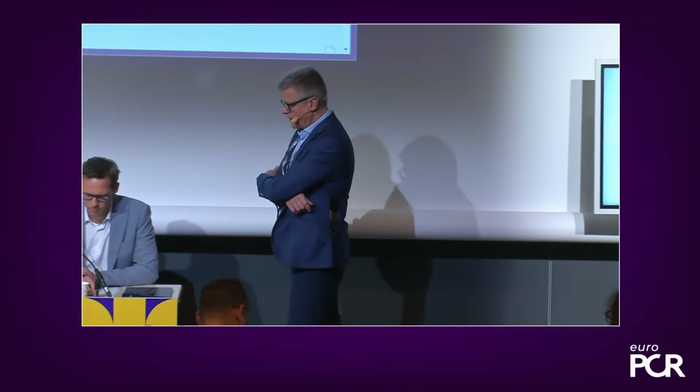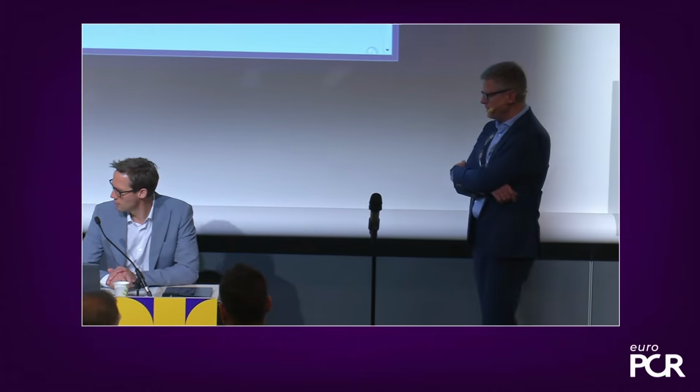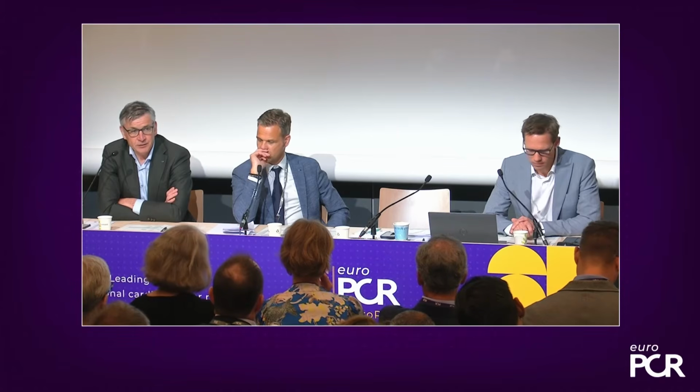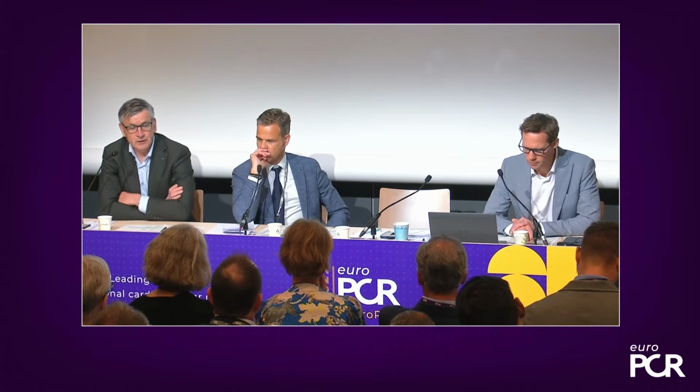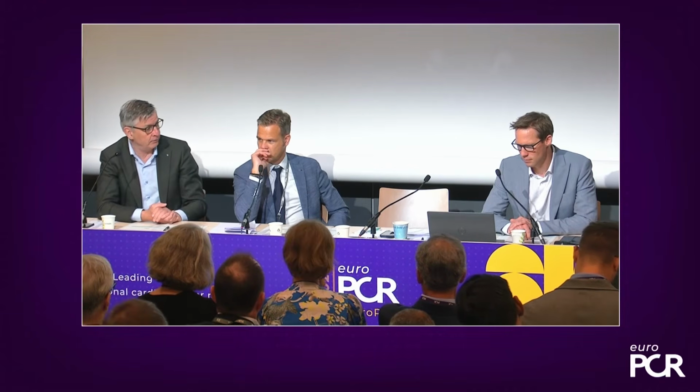You also demonstrated the use of a 4D ICE probe, so you have also been using 2D ICE probes. Do you think that this provides you with some advantages for LAAC? I think there's some advantage with it. Of course, since you have the CT scan up front, you have all your measurements before you go into the procedure, so you don't need the same accuracy. But I think it's nice to guide the procedure as well.